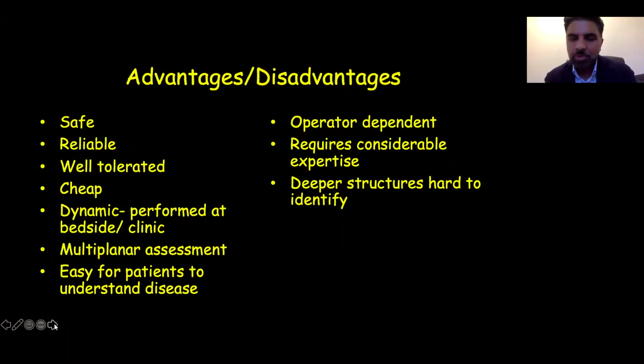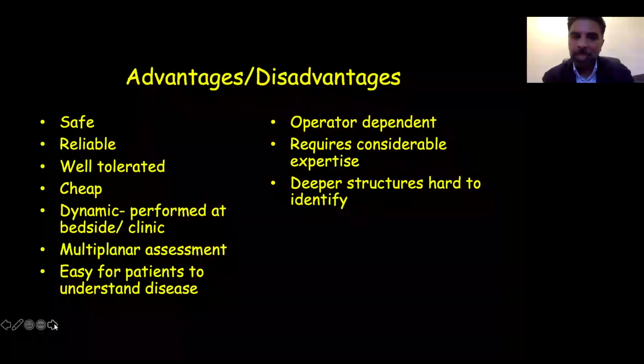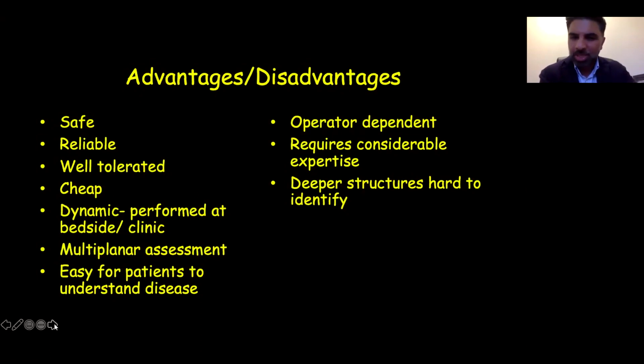What I find in rheumatology is that it actually helps patients really understand their disease. It really helps them understand what's actually happening at this present moment in time. Sometimes patients will say, I've got pain and stiffness. And then if you can show them on the scan, look, this is what's going on, this is what we're going to do, it really helps them feel a bit more empowered.